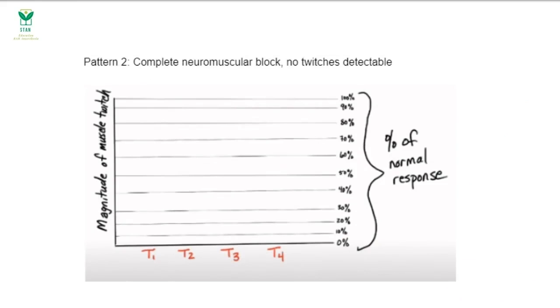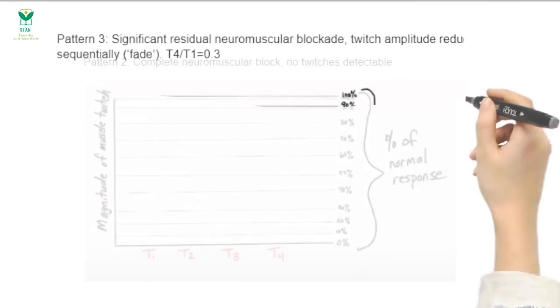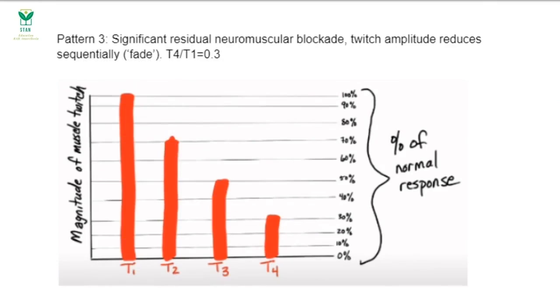In this second pattern, there's deep, complete neuromuscular block and no twitches are detectable at all. In this pattern, there is significant residual neuromuscular block. Twitch amplitude reduces sequentially from T1 to T4, with each successive muscle contraction weaker than the one preceding.